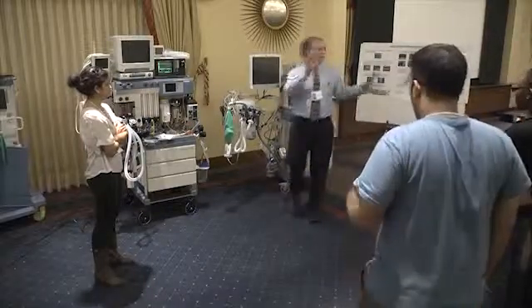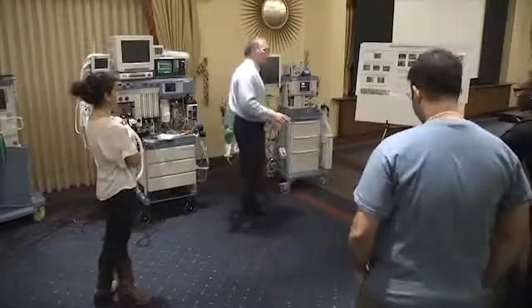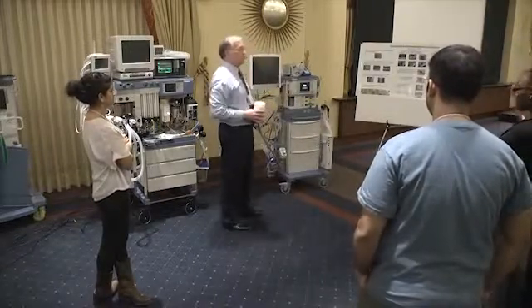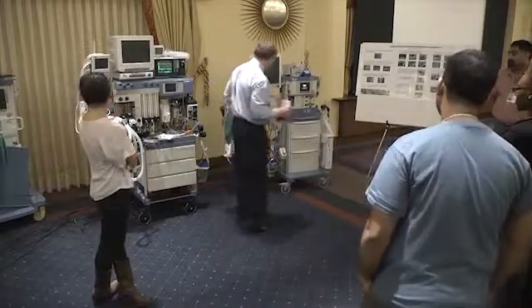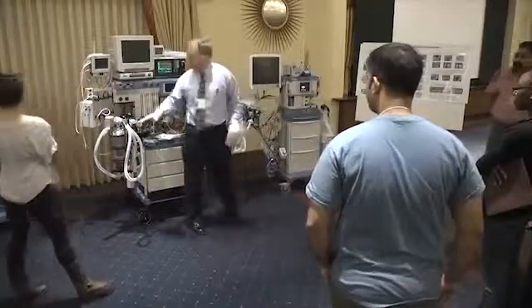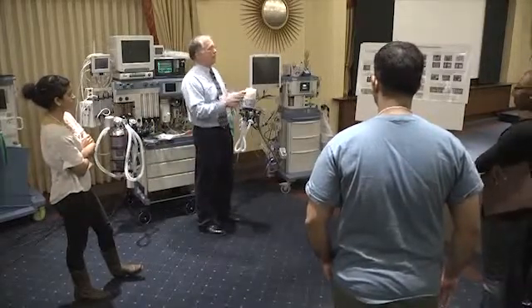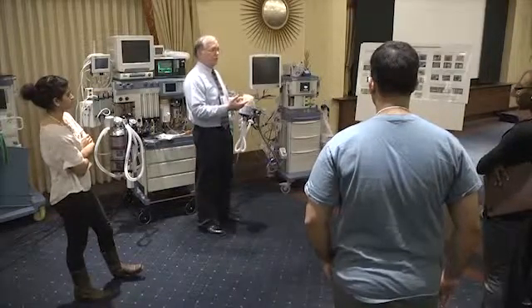CO2 absorbent. There's another station that's going to be developed specifically for that, but we have a couple of different types here. This kind right here can actually be taken off the machine, and we do not have a leak in our machine at that point, so you can do this live on a case. Now, you can do that on the Apollo, and you can do that on this machine, but this machine right here, you cannot. You need to know that they usually say if this is half full, replace it. And if it's a little bit in the purple and you're doing a short case, you can get through it, or you can just change it on the fly.